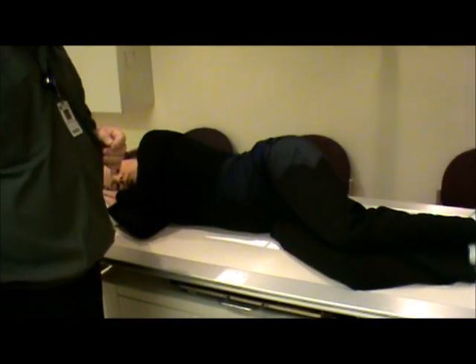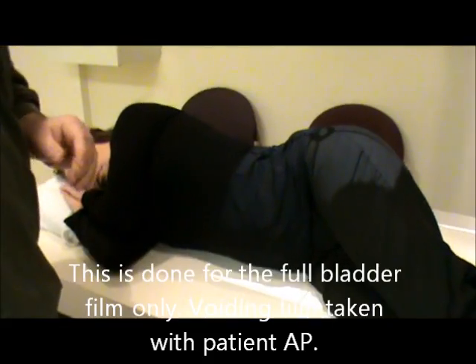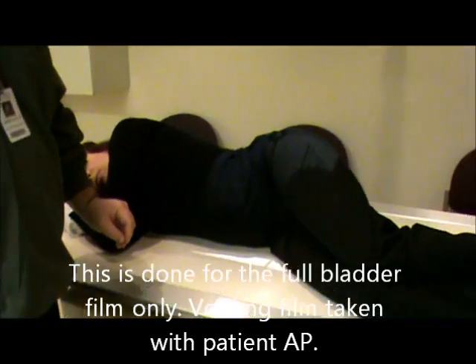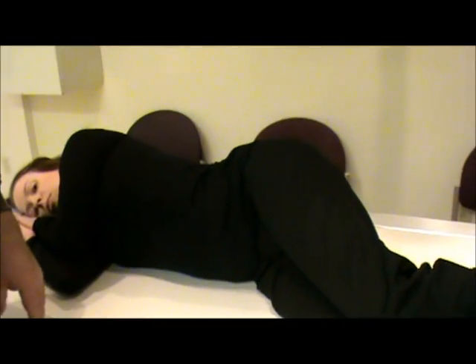We're going to put towels and chucks here to cover up so that when the patient voids there's no mess. We step to the back to shoot the film, and we tell the patient to try to void. When they're voiding they can tell us — we may again have to turn water on to help them. Once we shoot the voiding film, we go back to the radiologist, let them look at it, and make sure they've seen all they need on the voiding part of the study. If they have, we let the patient go to the bathroom to continue voiding, then come back and do the post-void film on the female patient. This concludes our VCUG for male and female patients.